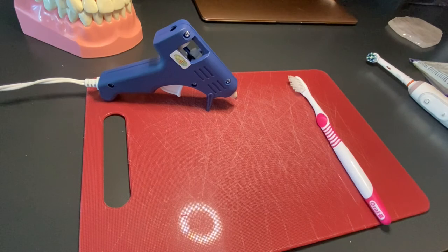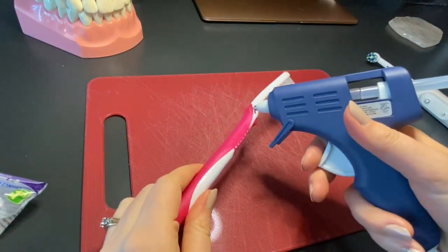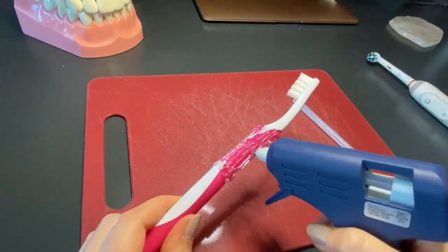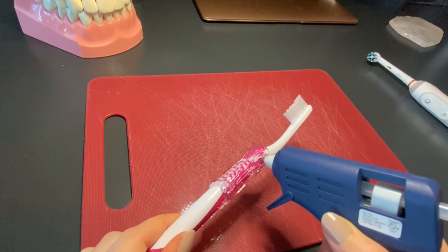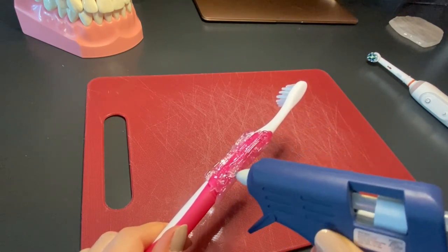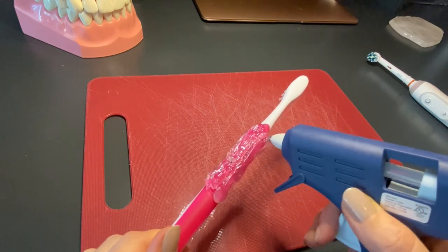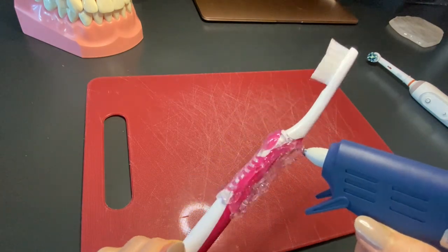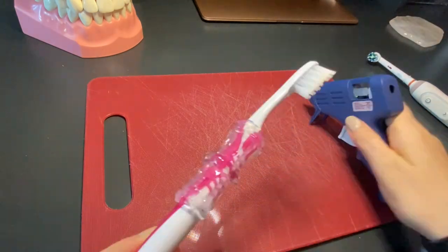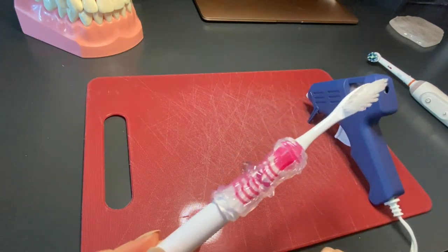Another way to adapt your toothbrush to make a bigger handle is to use hot glue. You just start around where the normal handle is — this can take a while depending on how thick you want the plastic to be. The reason I like this method, even though it's more time consuming, is that it's easier to clean and you can make it whatever shape you want. You can add as much glue as you want in different areas — thicker at the bottom or thicker at the top, whatever is easier for you.